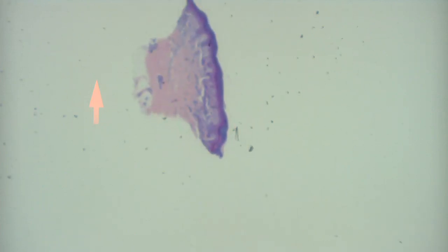Okay, what do we got here? It's a nice example of this. This looks like a tiny punch. A small punch goes with fat. Any clue as to the age of the patient? Young. Yeah, probably a child, maybe even a baby.